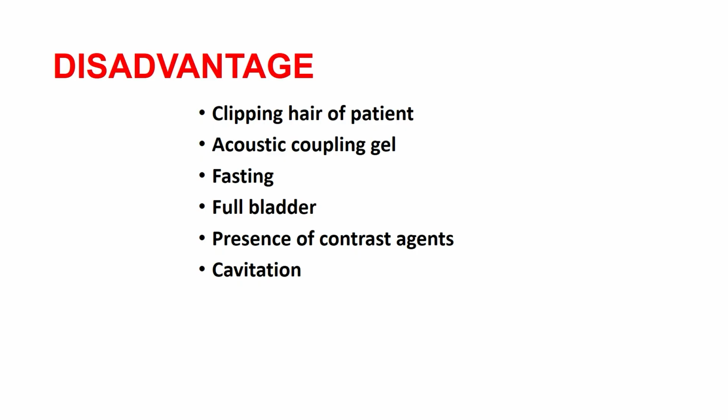Now, let us discuss the disadvantages. As you know, animal patients have a lot of hair, so clipping of hair is a must to perform ultrasonography in veterinary patients. To minimize the transducer-skin air gap, use acoustic coupling gel to make proper contact between the transducer and the skin.